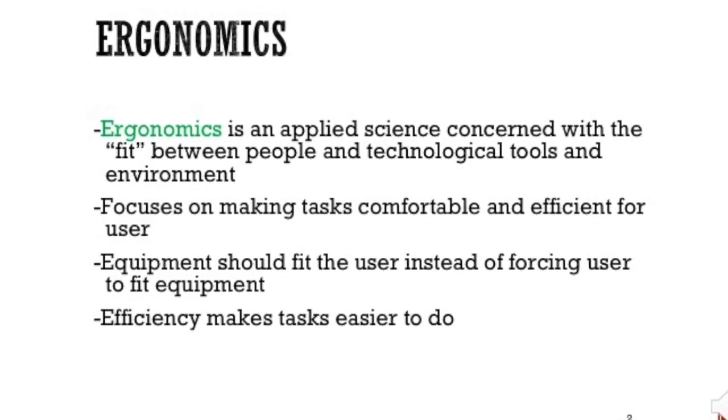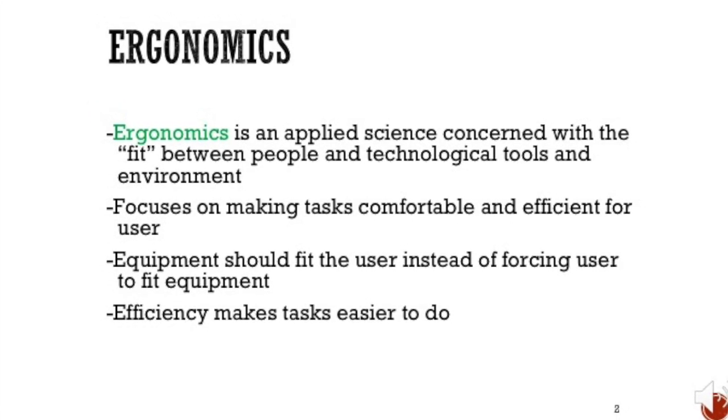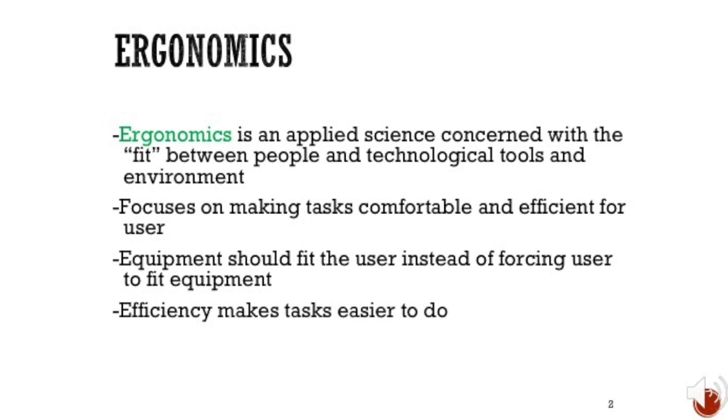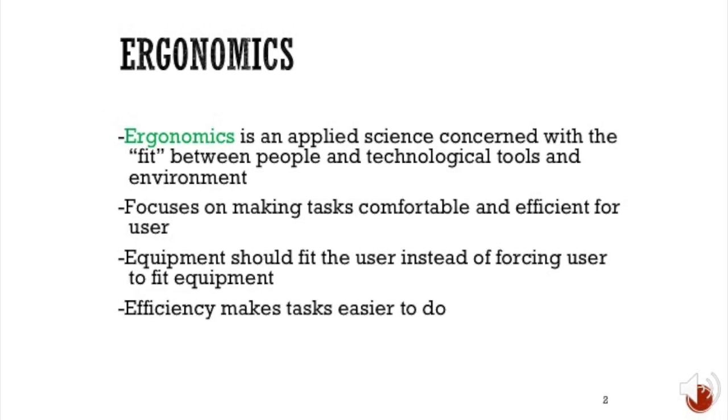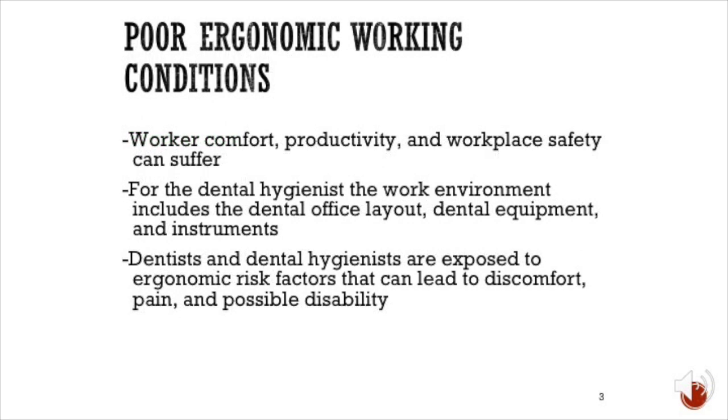Ergonomics is the science that is concerned with the fit between people, technological tools, and the environment. It focuses on making daily tasks comfortable and efficient and reducing bodily harm. The science of ergonomics is important for worker comfort, productivity, and workplace safety. For dental health care providers, the work environment includes the office layout, the dental equipment, and dental instruments.